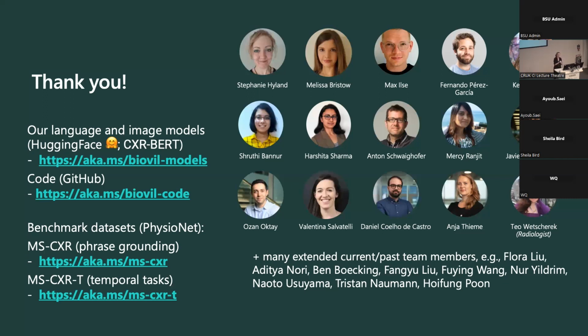So there's two answers to that. The first one is we're also using a pre-trained language model. So we're reusing some BERT model, which we also do some domain-specific pre-training. The second answer is since we worked on this, we've actually moved to generating the findings section because we think that's a more appropriate thing to do because that's more fully based in the image, and the findings sections are actually longer.